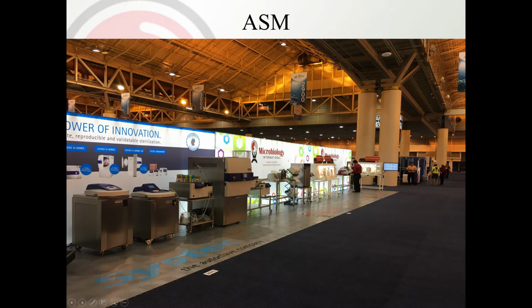So this is a brief look at what we would do if we were attending meetings these days. This is our layout at a recent ASM meeting that shows the breadth of the product line that we offer.